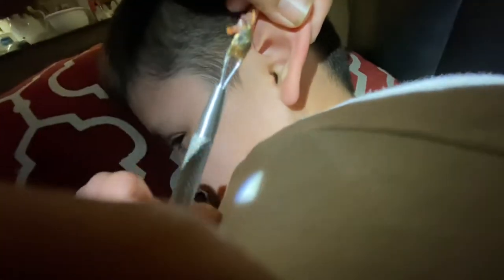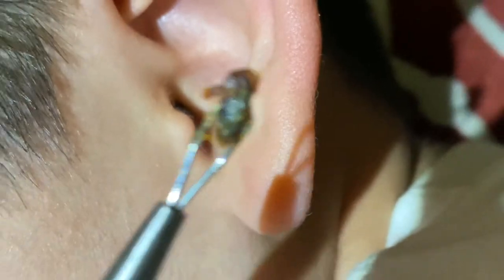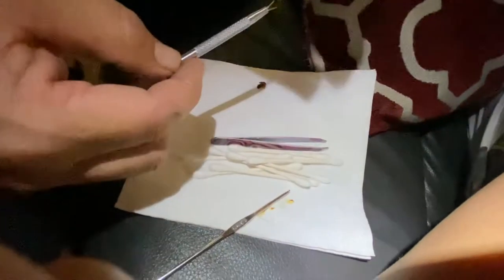Oh look at this — whoa! Record that. Look at that, that's super — it's cool, we're recording. Yeah, look at this greenness. Can I see it? Record it right there, don't zoom too much because then people won't be able to see. Look at that. Don't zoom too much — too much detail.